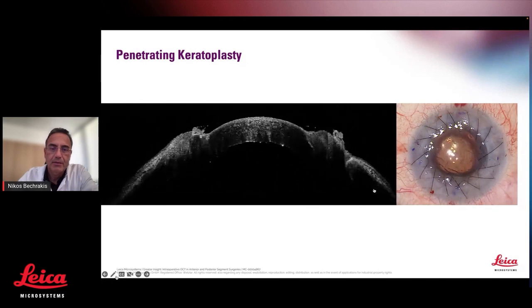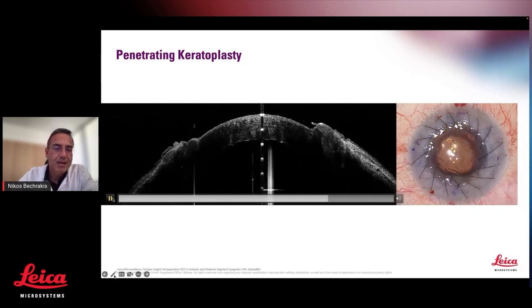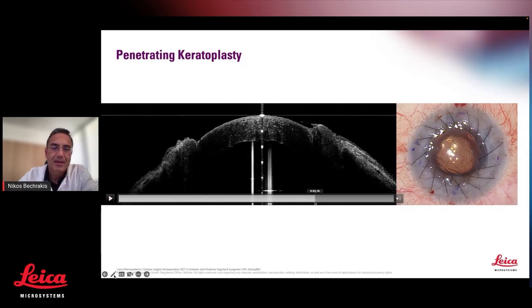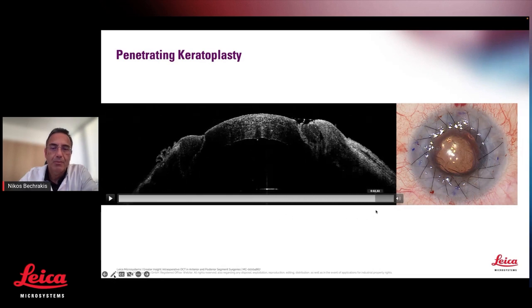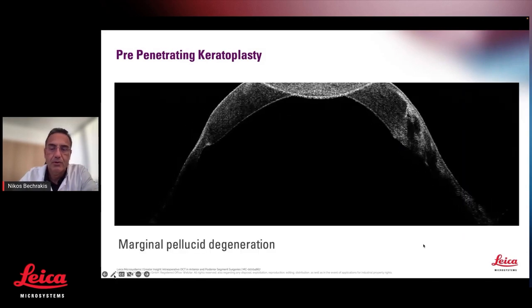And so at the end, you can try to get the best possible positioning, as you can see here, and get the best possible adaptation in this complicated situation where you had an eye that had previous cataract surgery.